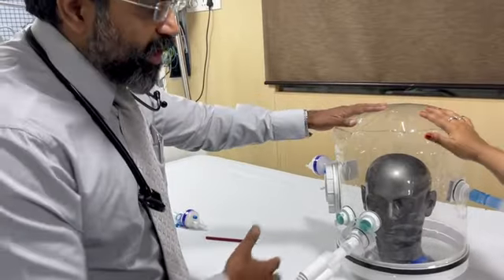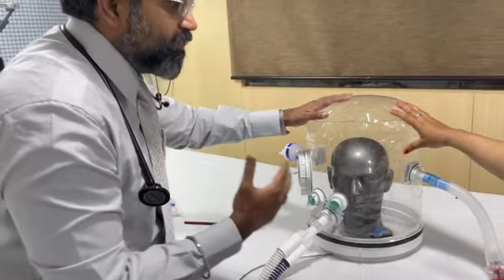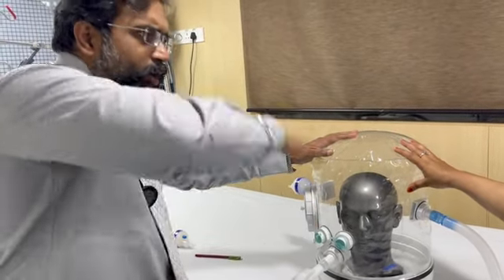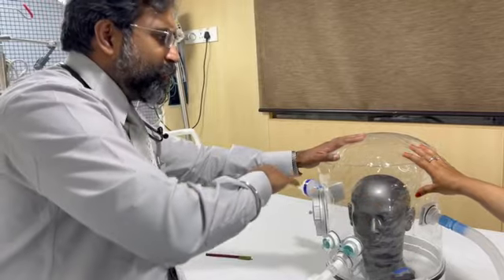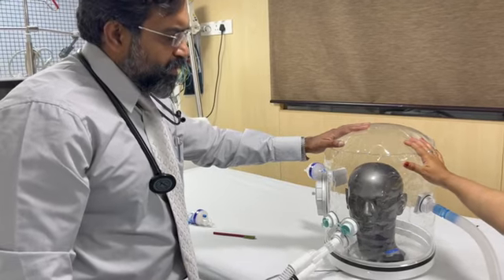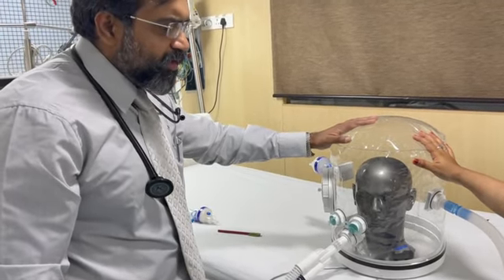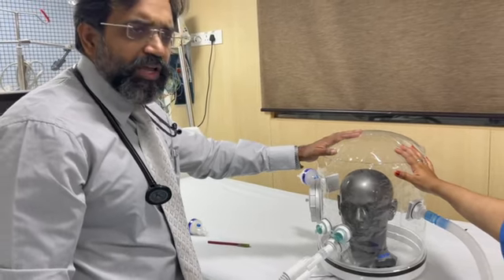This device will allow the person to see all across. There is no obstruction from anywhere and no creation of any pressure. This person can also be turned prone, if he wants to be prone ventilated, he can be lied down on prone ventilation, and this will work as well as any other device, and in fact better than the other devices. So this completes everything about high flow, the helmet CPAP, the helmet interface when using it for NIV. Thank you very much.